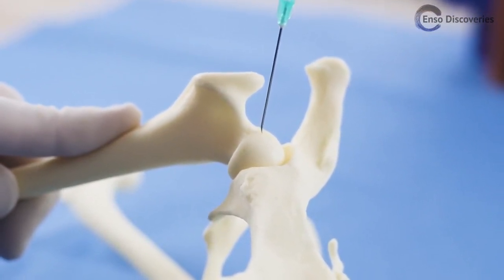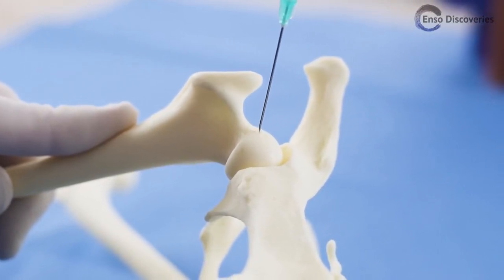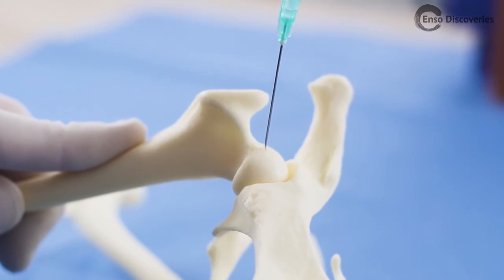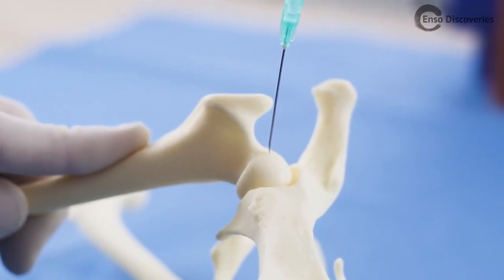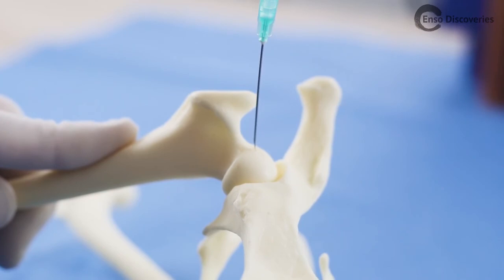It is best to begin walking towards the trochanter. If you were to walk dorsal, the needle could fall off of the pelvis and this would mimic the feeling of falling into the joint. Important note: you do not have to fall into the joint to actually be in the joint space. Falling into the joint space is nice because the unique feel makes you very confident your needle is in the correct location.